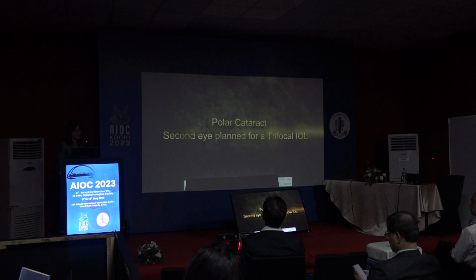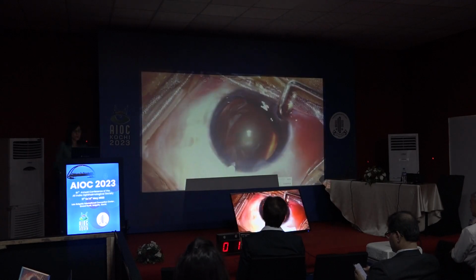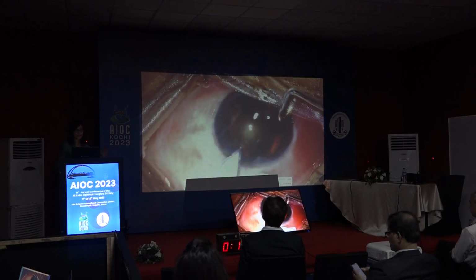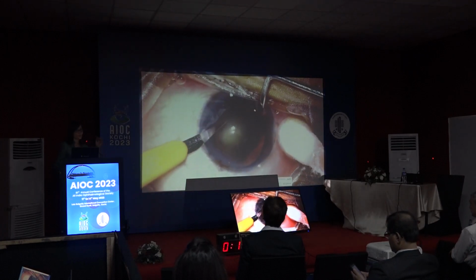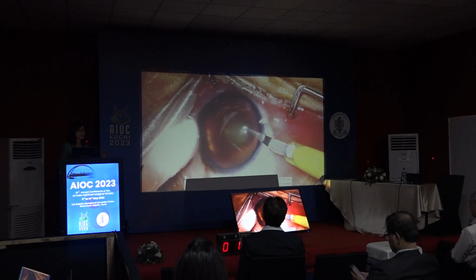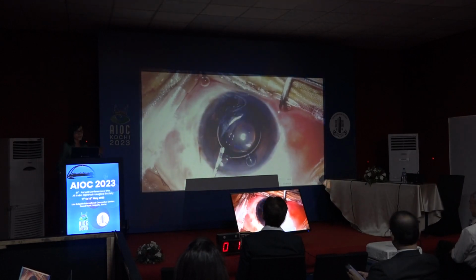Obviously, you talk to the patient that there's the possibility that it won't go through. We may not be able to put in a trifocal lens. And I thought I should just start with showing you the tips and tricks that I use, or rather, what is the technique that I follow to try and achieve a better end result each and every time. When you're looking at making your incisions in a patient with a polar cataract, you should avoid any kind of struggle during instrumentation. So take meticulous care and attention to detail while creating the incisions.